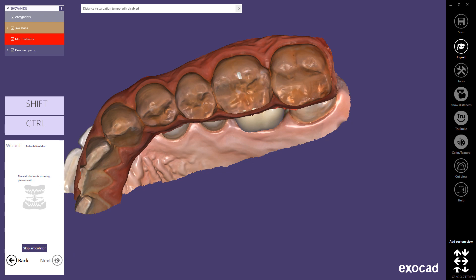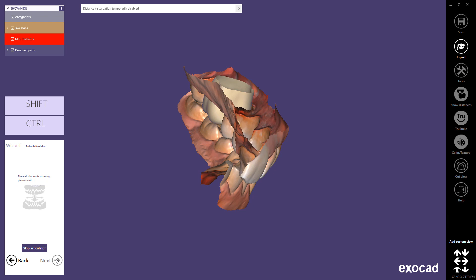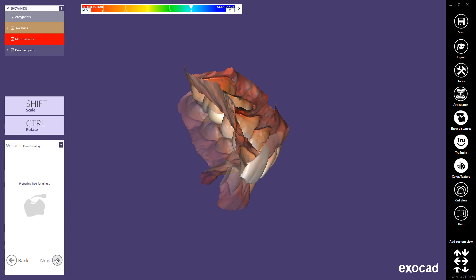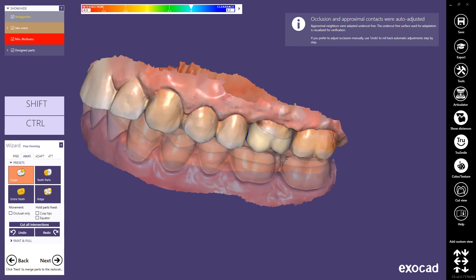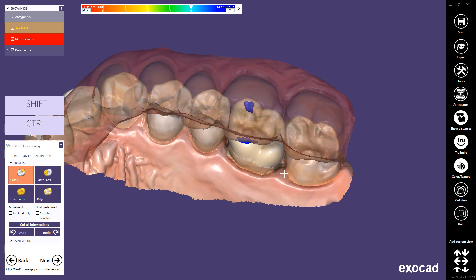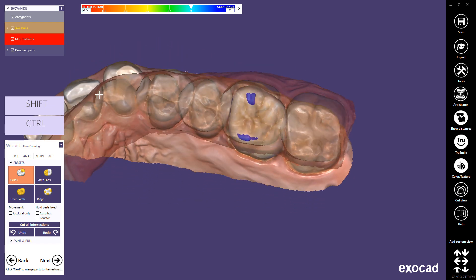The calculation for the auto-articulator will start automatically, and in the main view you can see the articulator movements. At this stage, by accessing the free-forming step, Chairside CAD automatically adapts model teeth to the preparation margin, the antagonist, adjacent teeth, and, if applicable, pontics to the gingiva. This means that it cuts away existing intersections, following the default value of material configurations from the manufacturers.